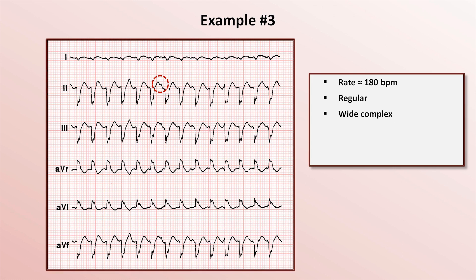This corresponds to similar bumps in leads 3, AVF, and even AVR. If you saw this in just a single lead, you might speculate it was artifact of no consequence. However, seeing it in 4 different leads simultaneously strongly suggests it's something real — and that something real is a dissociated P-wave.